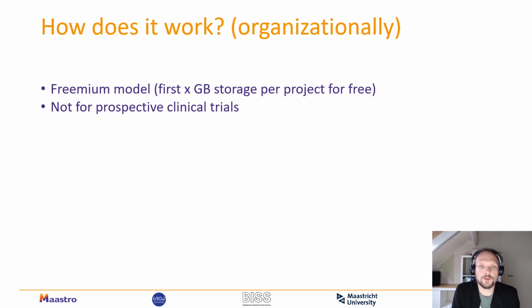The main reason to exclude these is that in prospective clinical trials, for example, hospitals A, B, and C need to upload images, and some expert will review these images centrally before a treatment decision is made. We don't want to be involved in that, nor does a health authority, mainly because there are a lot of liabilities, and also uptime guarantees, which at the moment we cannot facilitate, because it would mean that we need a 24/7 service desk, for example.